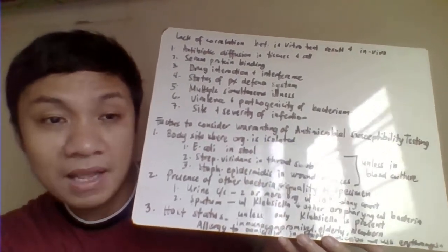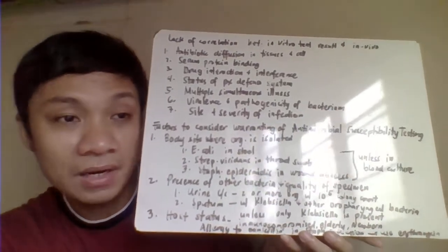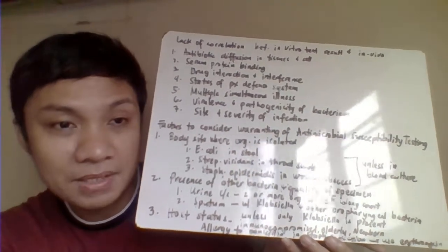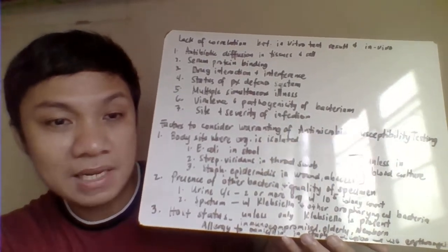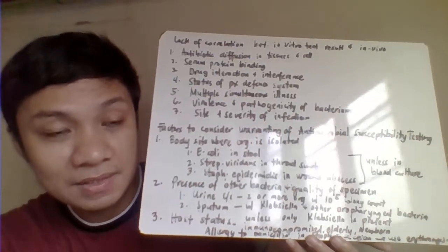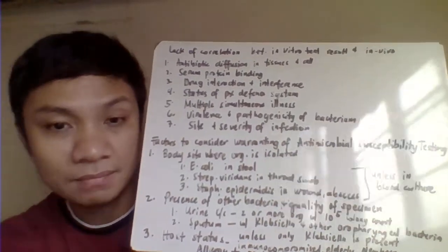Like, baka maging effective sa kanya ang erythromycin. But never ever go with your penicillin kasi given na yan na allergic reaction ang patient natin. We'll just be wasting our time and effort na mag-culture and sensitivity pa tayo with the penicillin as your antibiotic. Kasi hindi mo naman ibibigay yan sa patient. Kasi nga allergic reaction ng ating patient with your penicillin.